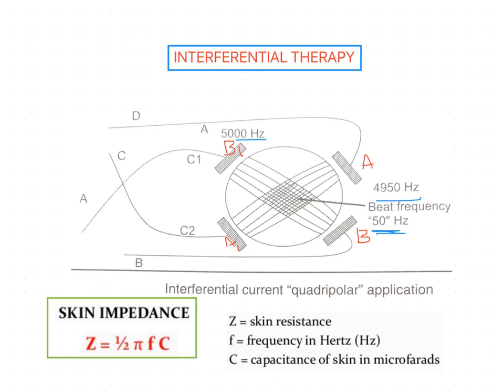A sophistication of this technique is to allow a frequency swing, in which a rhythmical progression is made through the full range of beat frequencies.